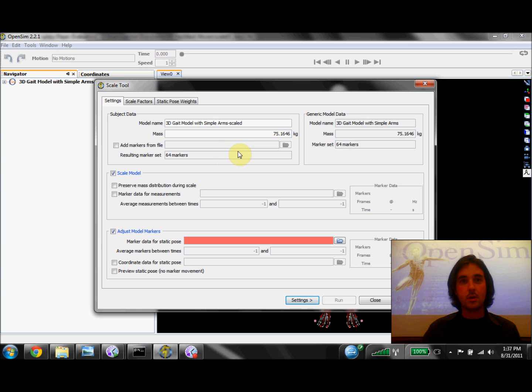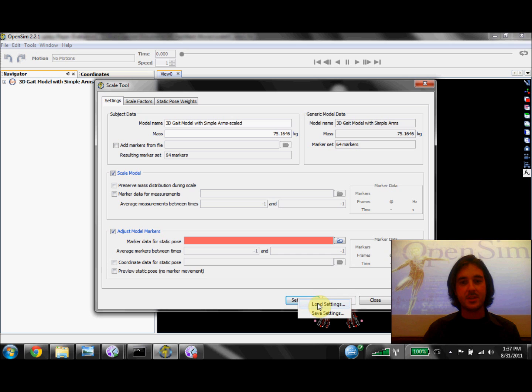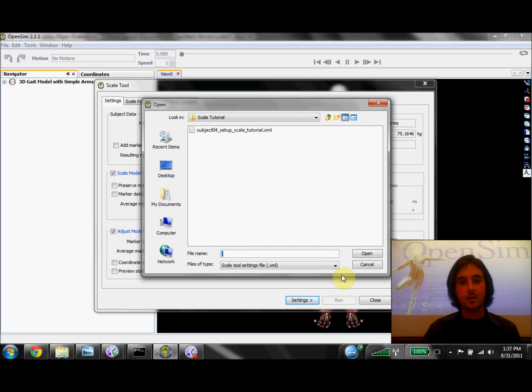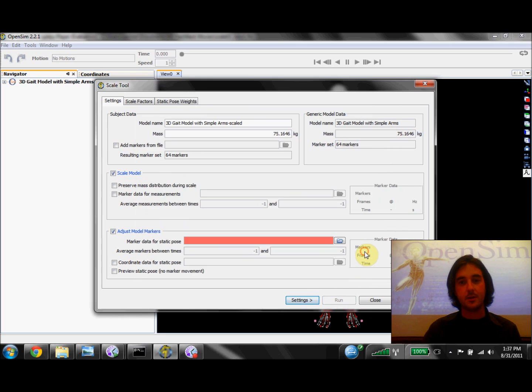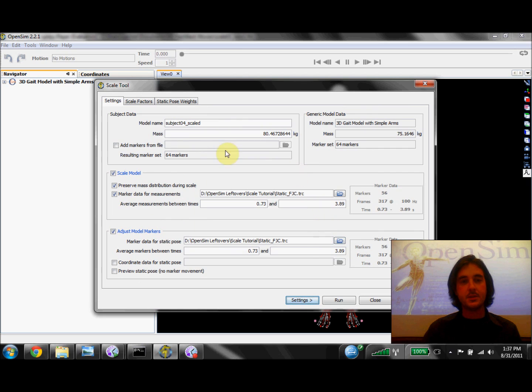Now I'll go ahead and load a settings file that I've already saved for one of my subjects by clicking on Settings, Load Settings, and then selecting the file. This fills the scale tool dialog with some key pieces of information.